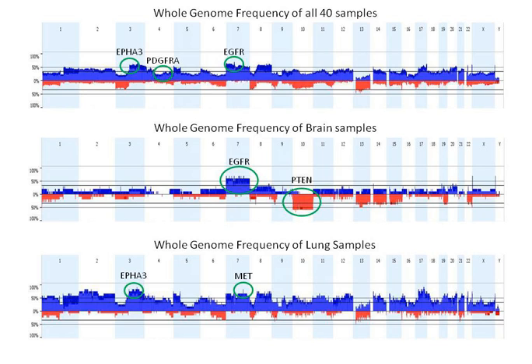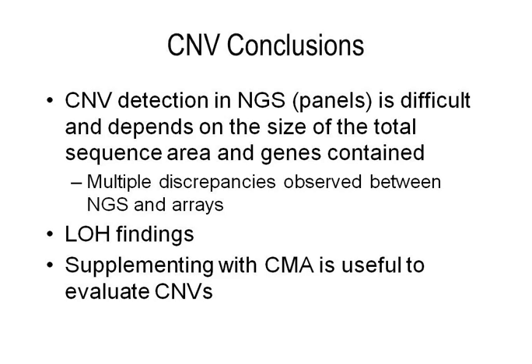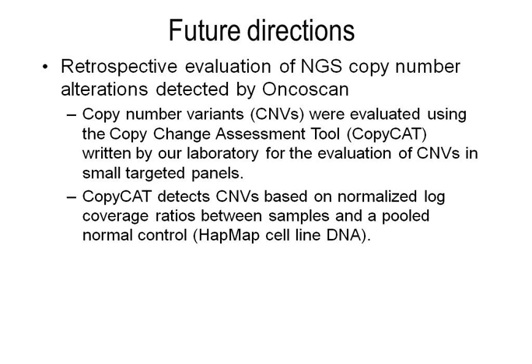So I think until we have better tools, and not only better tools, but until the NGS reads become longer, we will continue to have problems in CNV detection. I think OncoScan is a very useful tool to detect CNV in these tumors, and it's an important adjunct in our opinion. So we are obviously going back on the copy number NGS analysis.